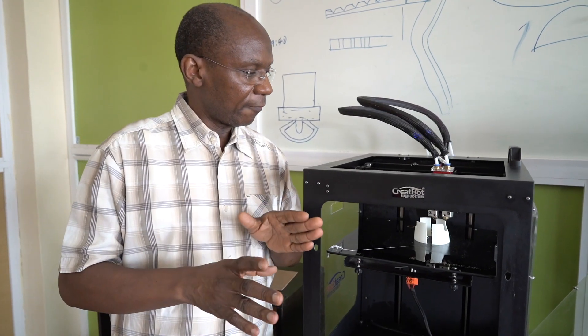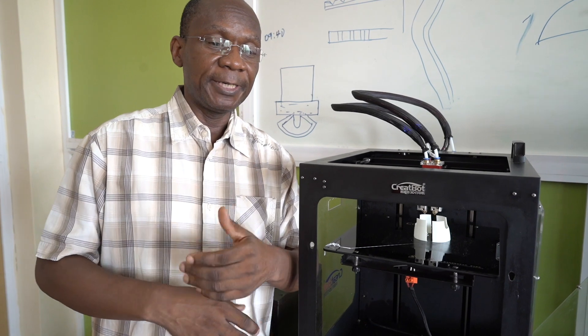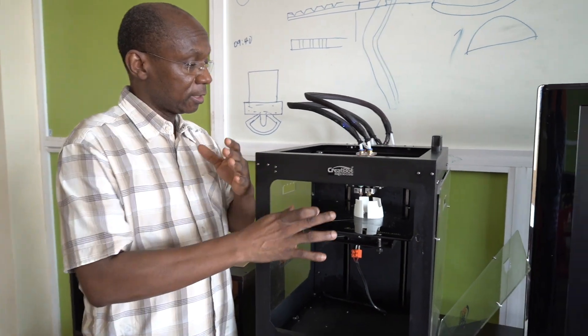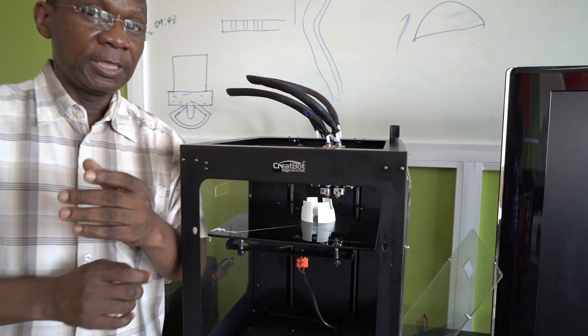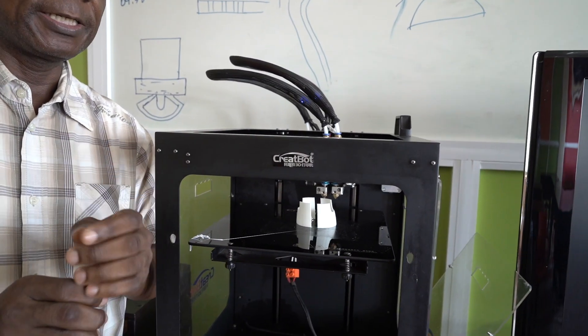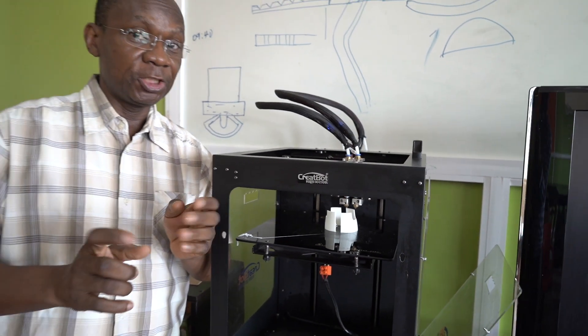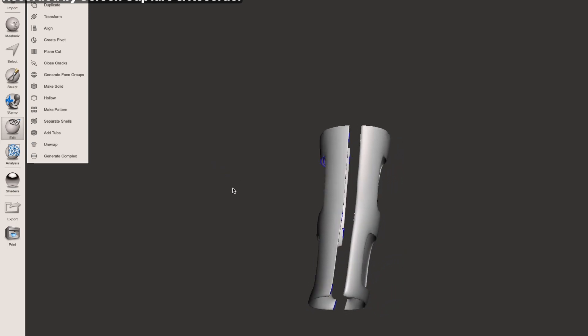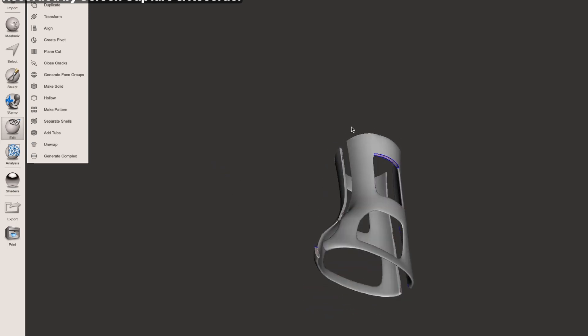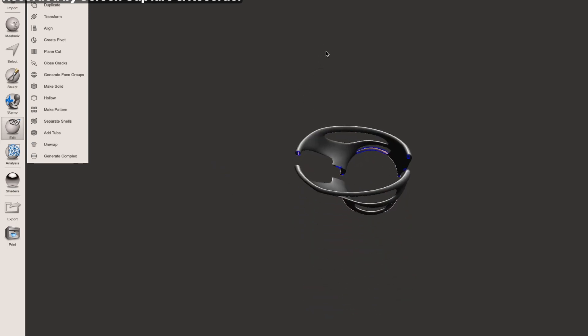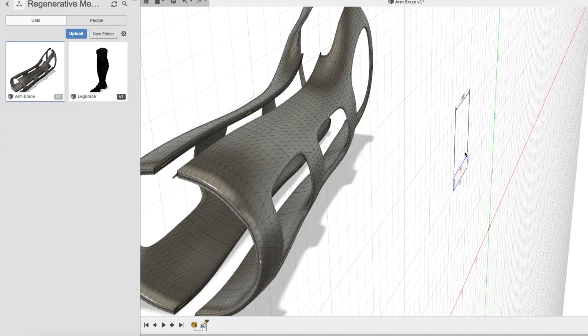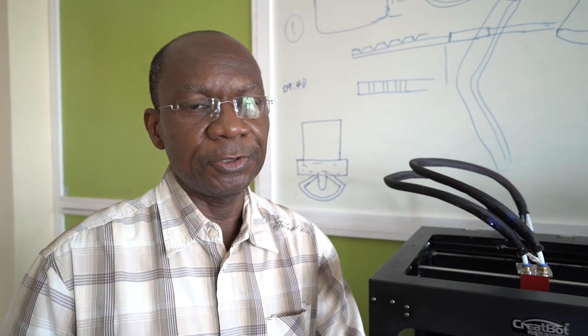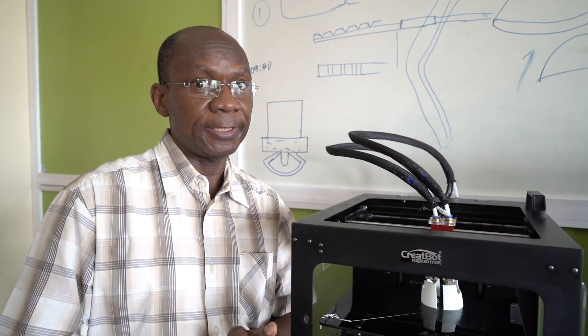What we're doing is one of our research projects where we want to replace the normal POP with this cast. What it means is no more itch. You can take your bath. It's lightweight. Every print matches the structure and shape of the individual patient. This has the advantage of providing perfect support for bone healing and the structure that's required.